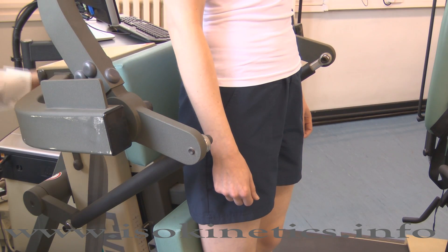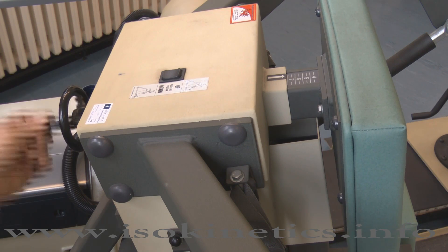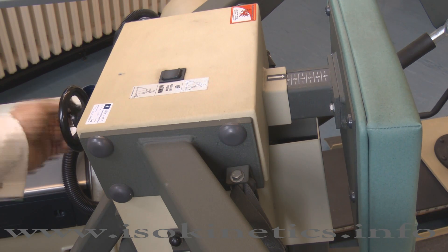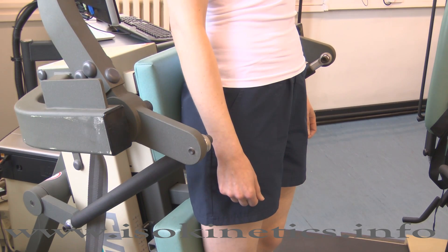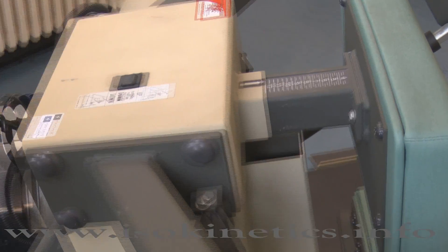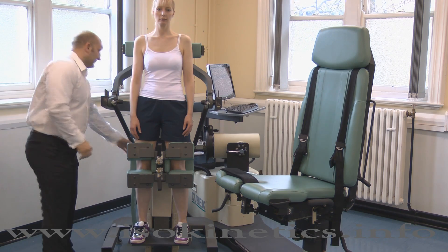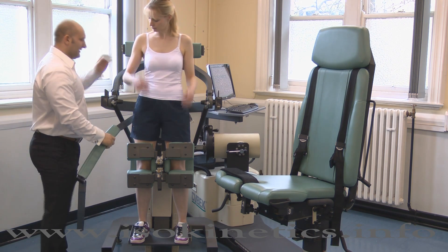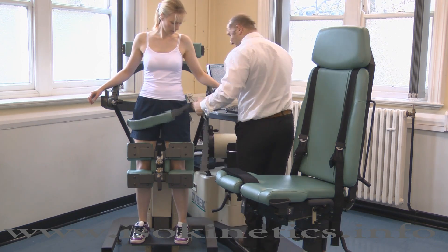Adjust the seat pad forwards or backwards using the adjustment wheel. The subject's pelvis should be in the neutral position. This is approximately when the rubber pointer is aligned with the mid axillary line. The position of the seat pad can be seen here. Attach the waist belt and adjust for comfortable tension by pulling the strap through the clip.